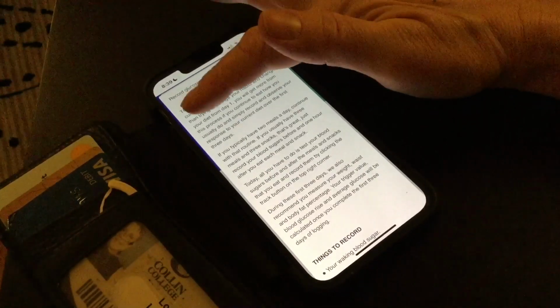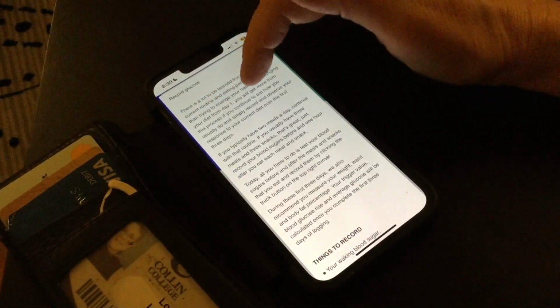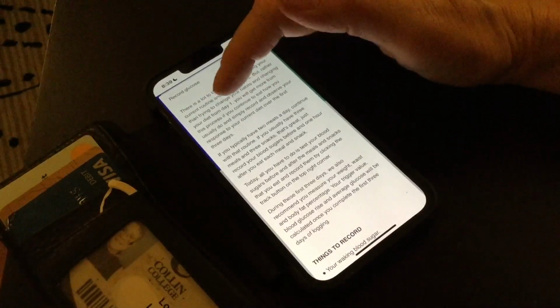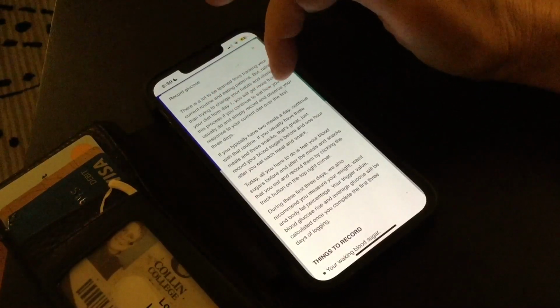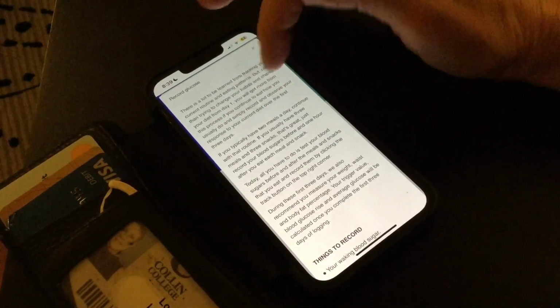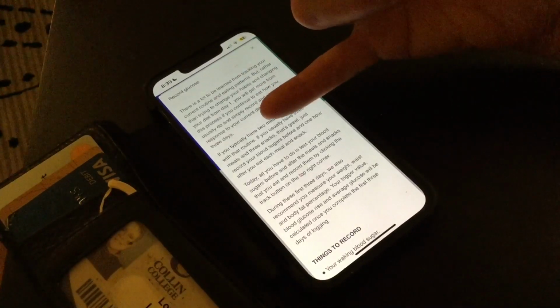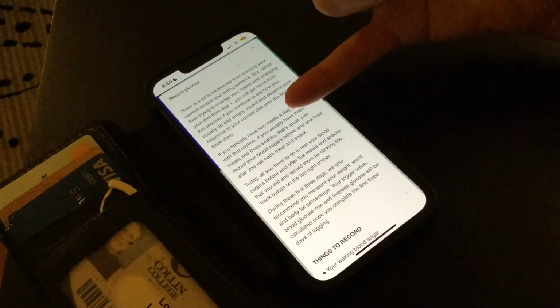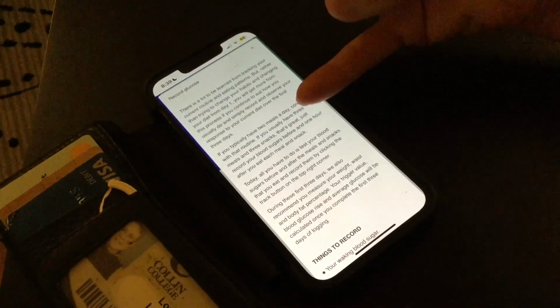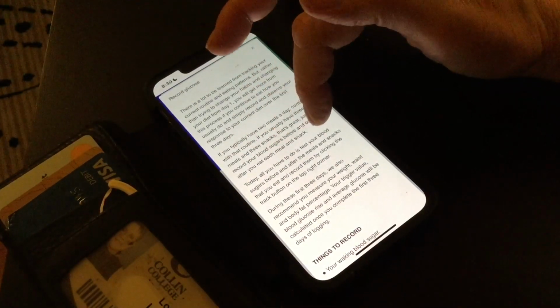But rather than trying to change your habits and changing your diet from day 1, you will get more from this process if you continue to eat how you usually do and simply record and observe your response to your current diet over the first 3 days. If you typically have 2 meals a day, continue with that routine. If you usually have 3 meals a day and 3 snacks, that's great. Just record your blood sugars before and 1 hour after you eat each meal and snack.